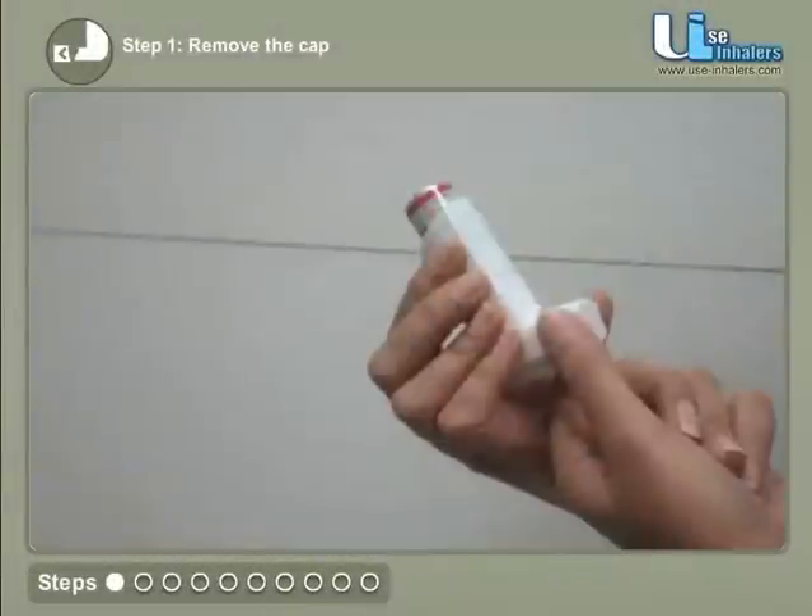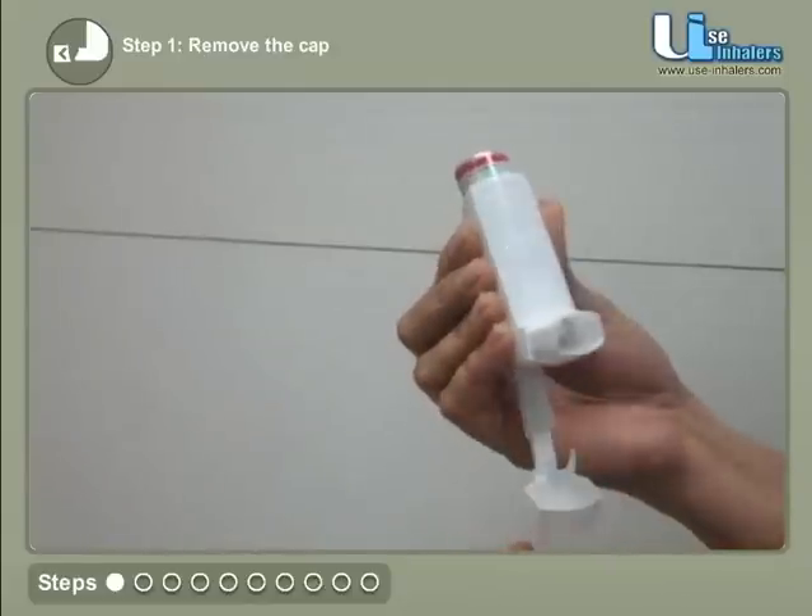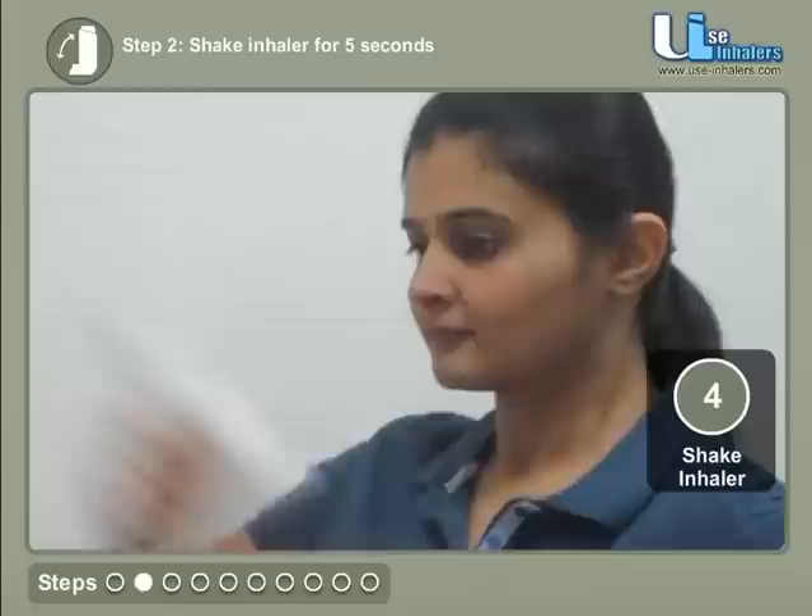Remove the cap from the inhaler. Shake the inhaler well for 5 seconds.